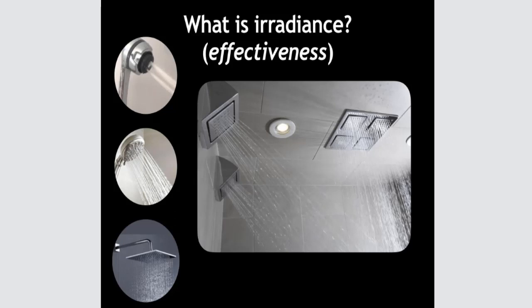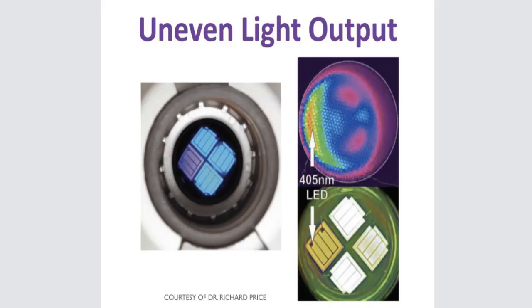And even this shower head is even better because it's got a wider range of water to be spread around. But I would tell you that this is the best shower you could ever get, because you can't help but get in this environment, right? So this is very effective. When we look at effectiveness, I want you to just have this mental picture in your mind, and this is what we're talking about with irradiance.